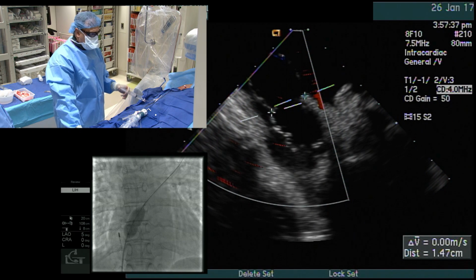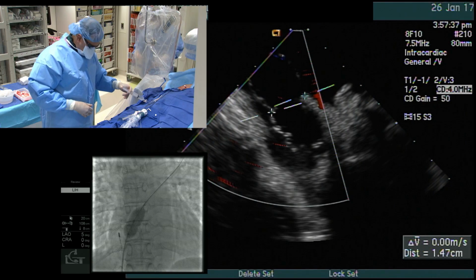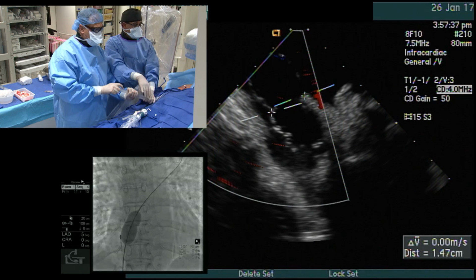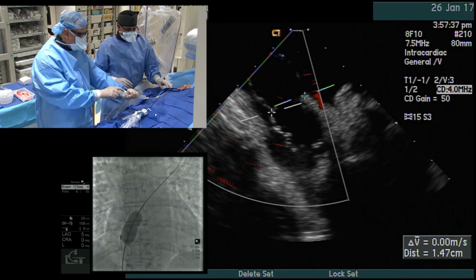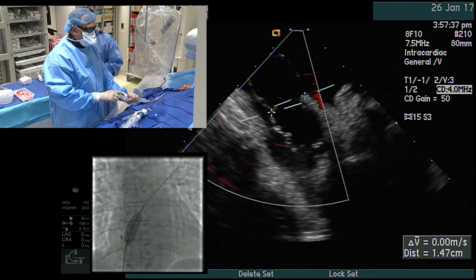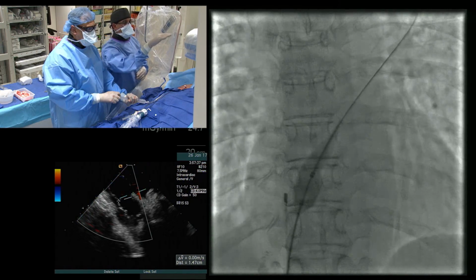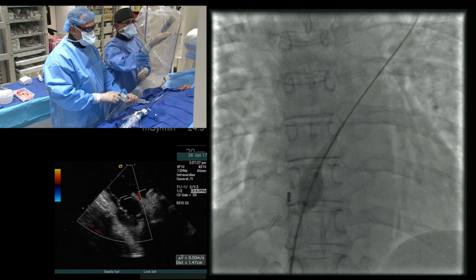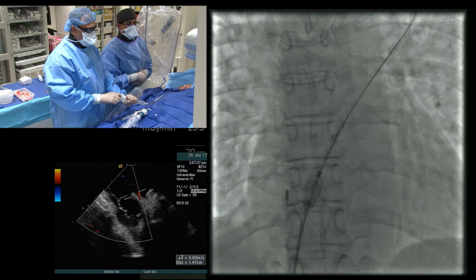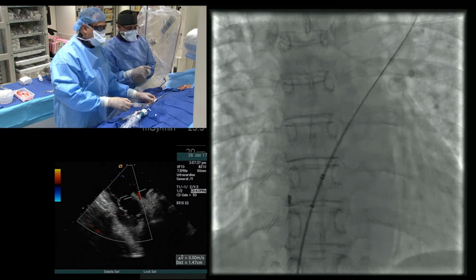14.7. Okay, now we're going to cine the balloon. Okay, come down. We're stretching that too much. And now we're also going to use the QCA measurement on the balloon to determine the diameter. From the proximal to mid marker, from the inner portions of those markers, is 15 millimeters. So for our QCA, we measure that as the standard reference. That's right.